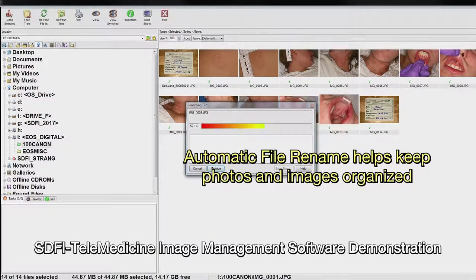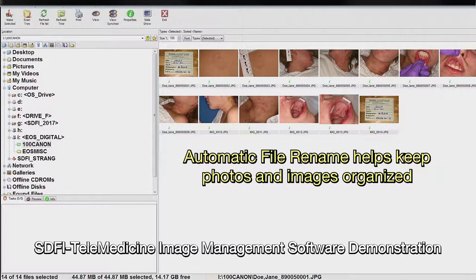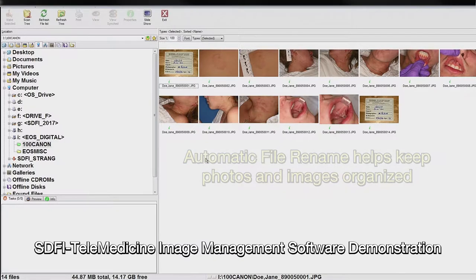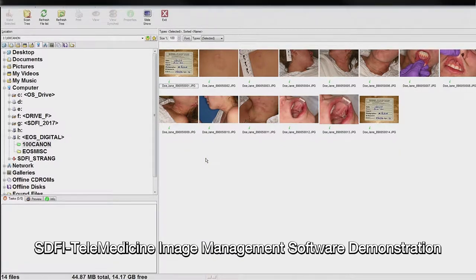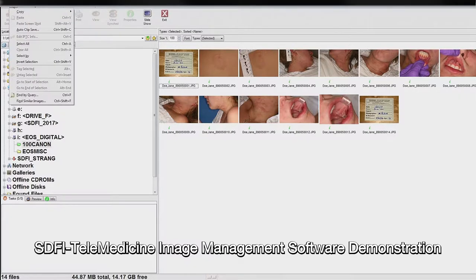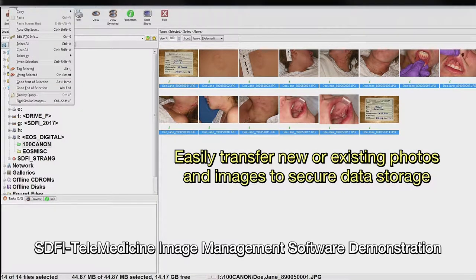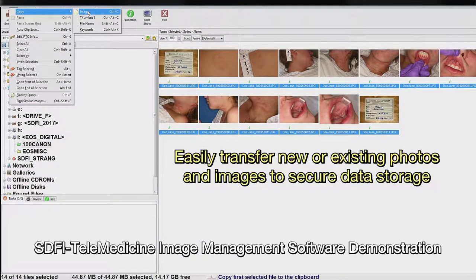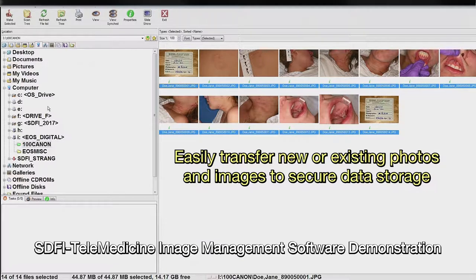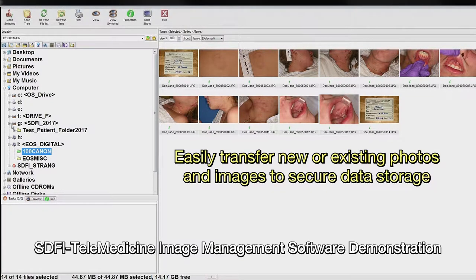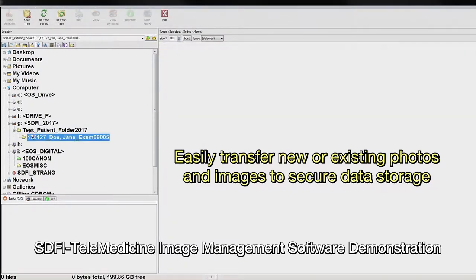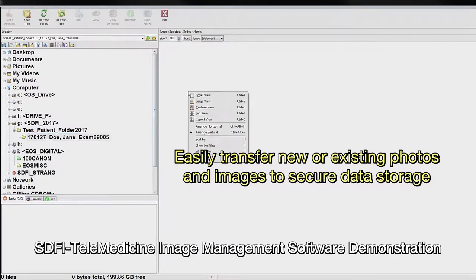Once the forensic data storage location is verified on the exam computer, connect your camera or memory card containing the exam photos to the computer and then copy all of the photos to the designated storage location. After all images have been verified as transferred from the camera or memory card to the designated storage location, be sure to delete the photos from the camera or memory card. This will ensure that the exam photos are not mixed with other case files and that the card will be ready to use again as needed.